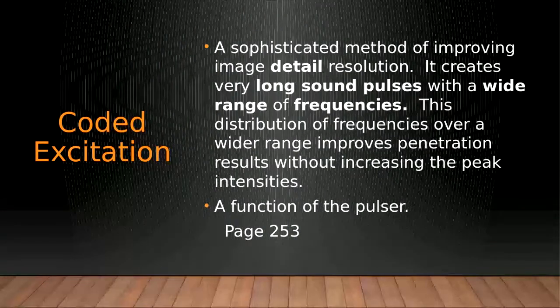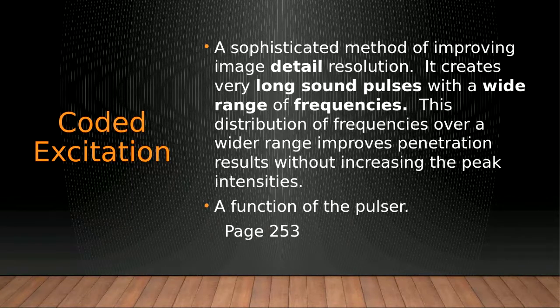So this is a sophisticated method of improving image detail. Okay, we want our detail resolution to improve. And it does this by creating long pulses with a wide range of frequencies. Now, I've bolded the following terms like long sound pulses, and let me underline them here too, with a wide range of frequencies, because some of the enhancement tools sound very similar. So it's really good if you can point out some of the differences or some of the key things that go along with the tool itself.